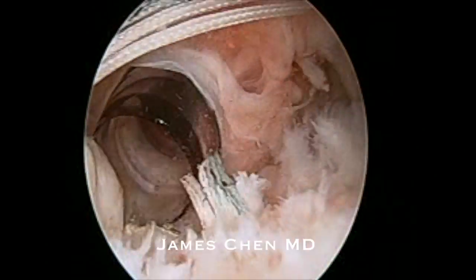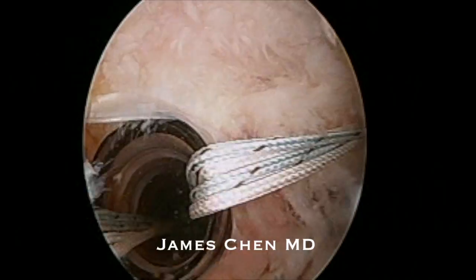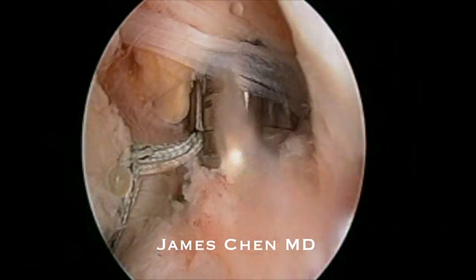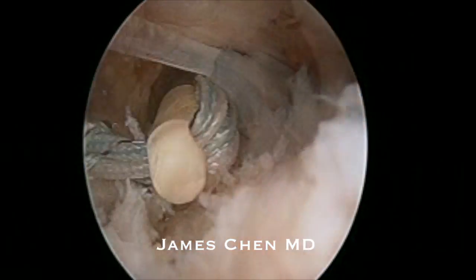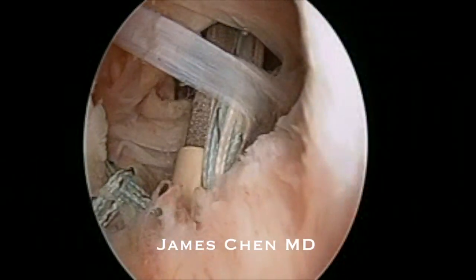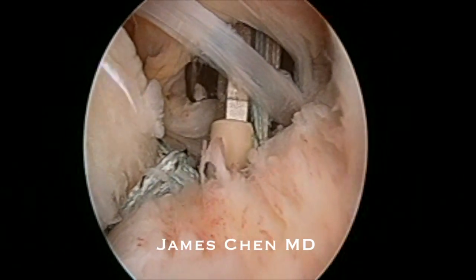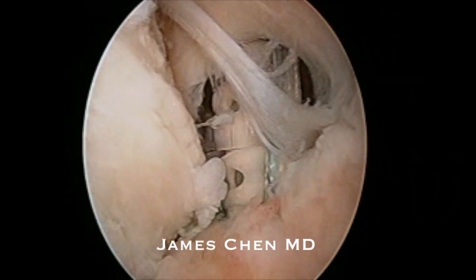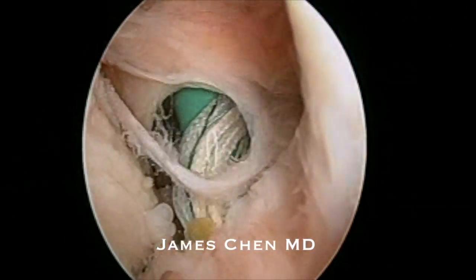I cut the residual suture and then retrieve through the anterior portal the second pair of racking hitch sutures. I punch a pilot hole for the swivel lock, then impact the swivel lock into the pilot hole, and then screw the swivel lock into the lesser tuberosity bone. You can see the subscapularis tendon being reduced to the lesser tuberosity.